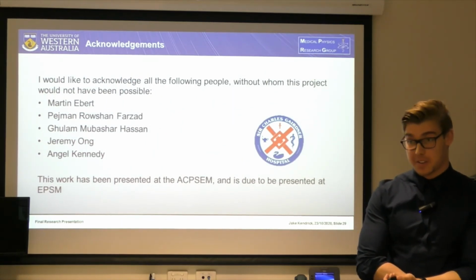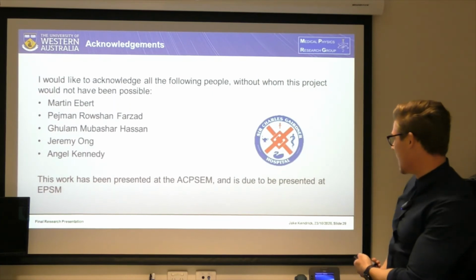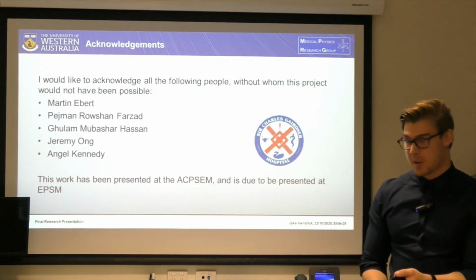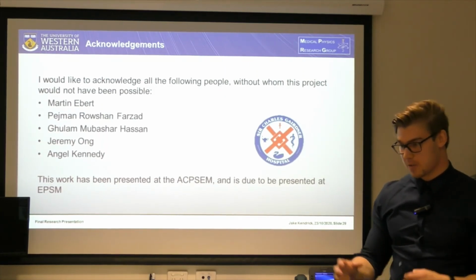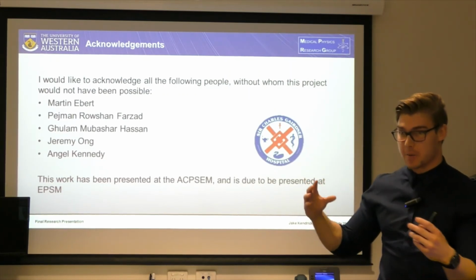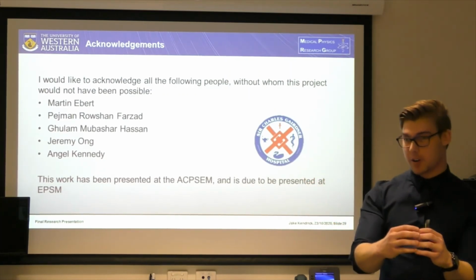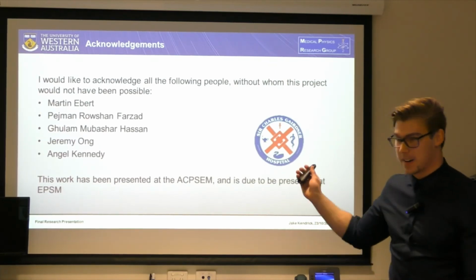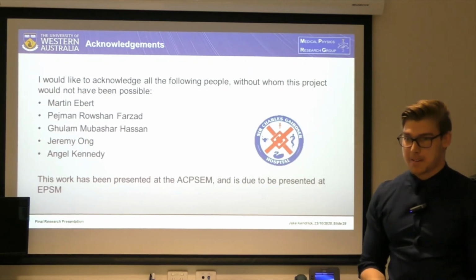I think that's a good thing to consider. I also think playing with other HU parameters as well, so other windowing and leveling parameters, is a good way to go. Definitely PET thresholding though, which might be able to reduce, because if we can reduce the amount of useless information in the image, then the model is going to be able to focus particularly on the stuff that it really needs to learn. So if we can threshold out some useless stuff, that's a good way to go as well, I think.